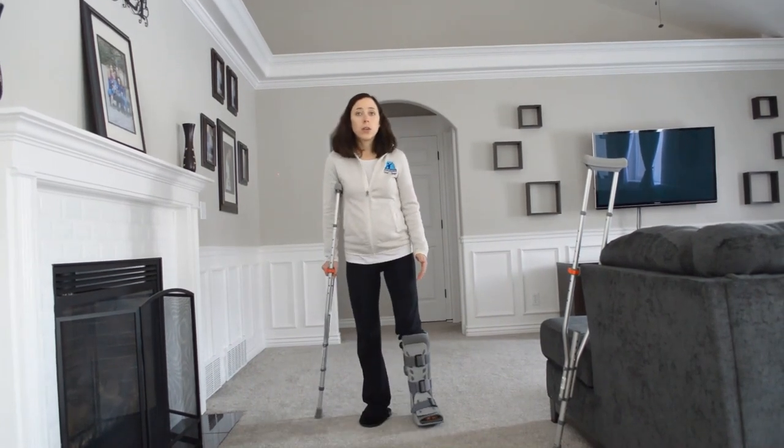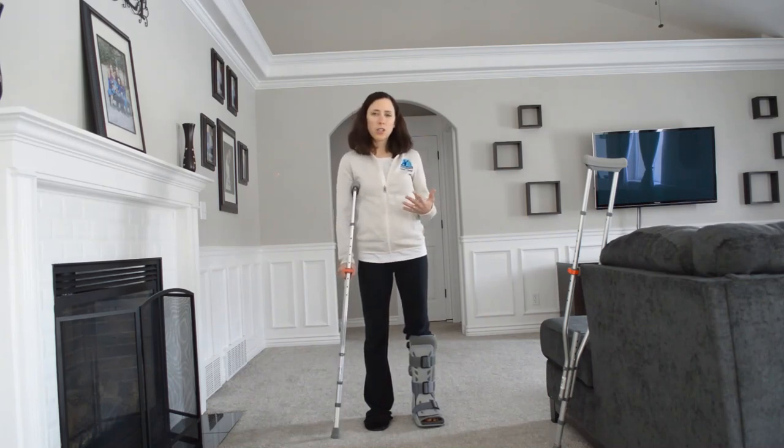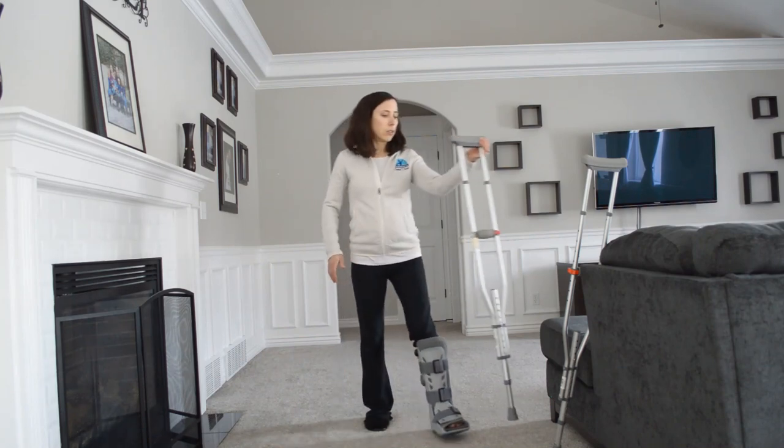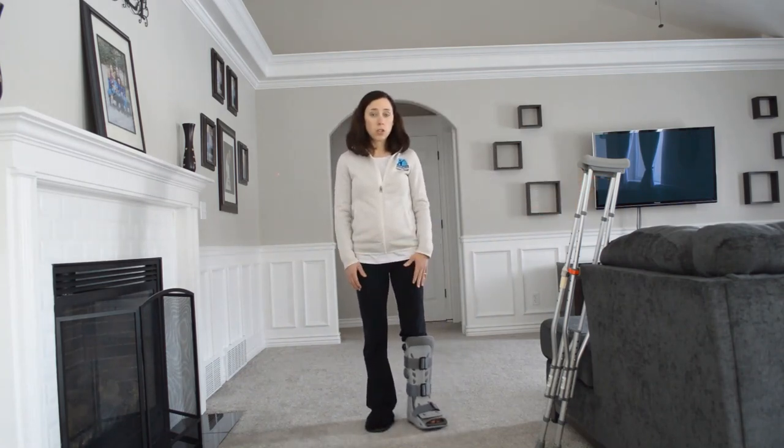Once you are able to do that pretty easily, you'll kind of know when you feel like you're not actually putting a lot of support into that crutch. Then you're able to go down to just the walking boot, or whatever they have you walking on, if you're back to just tennis shoes.